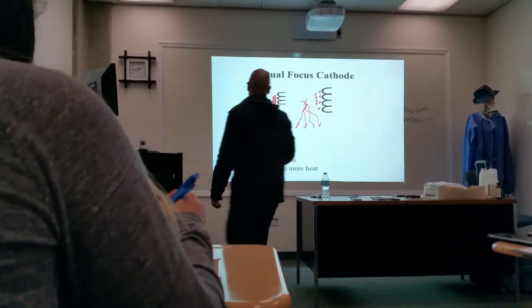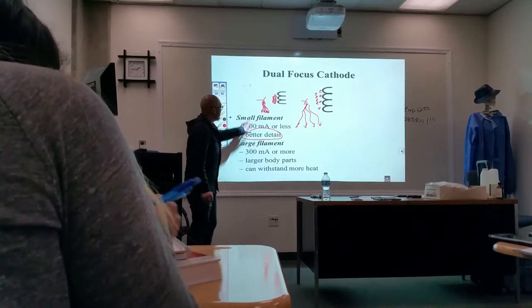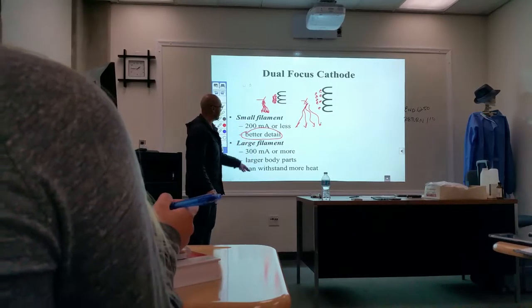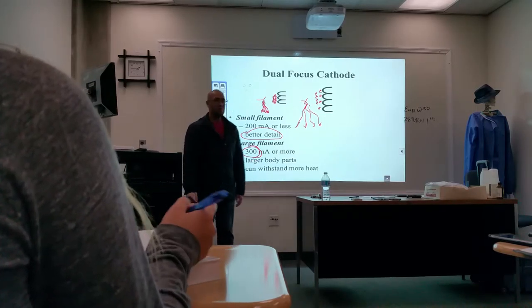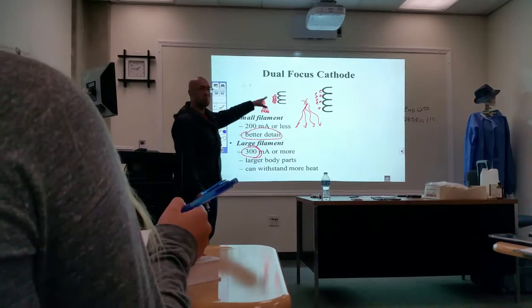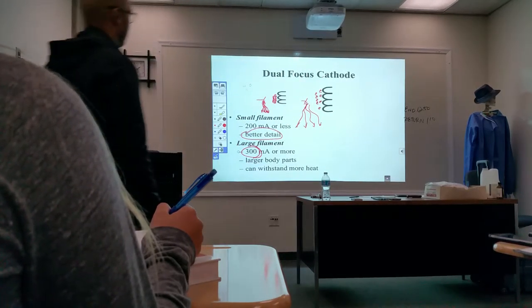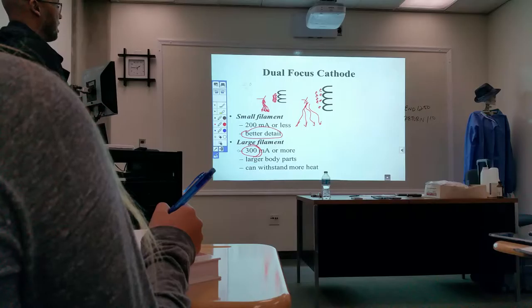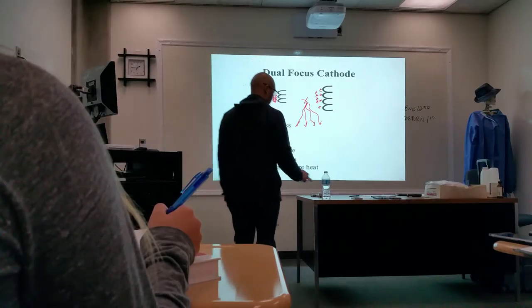So small filament for better detail, okay? We can't use this for larger body parts because for larger body parts, I want to use more MA. This is where you can impress more energy on a larger filament, okay? It can withstand more heat for larger body parts, okay?